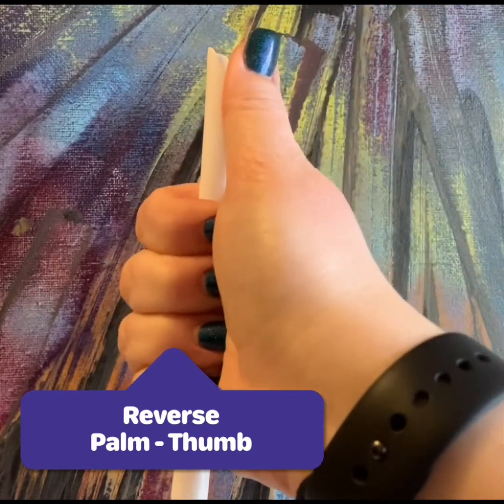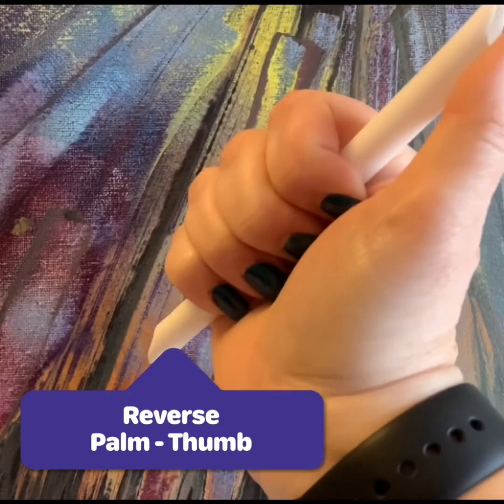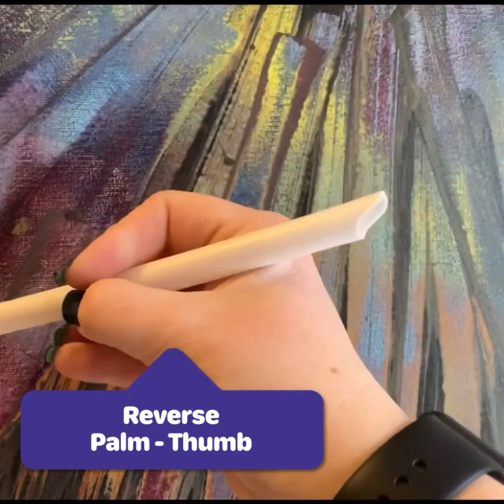You could probably use a palm thumb grasp as well, but you could use a reverse palm thumb and a pen grasp. Let's have a break of the hand.